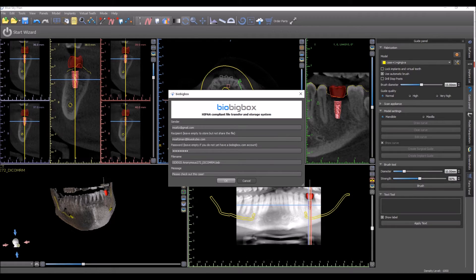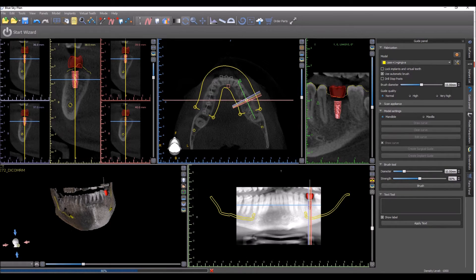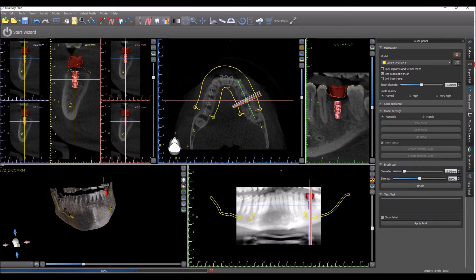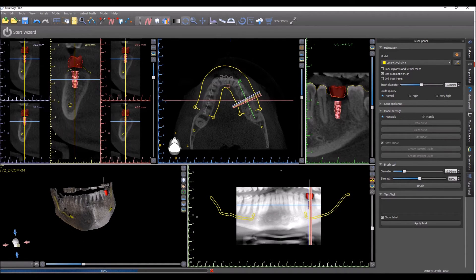When you press the OK button, you'll see a process bar appears on the bottom left and your case is being sent and transferred via BioBigBox. You can go ahead and continue using the Blue Sky Plan software while the transfer is happening.